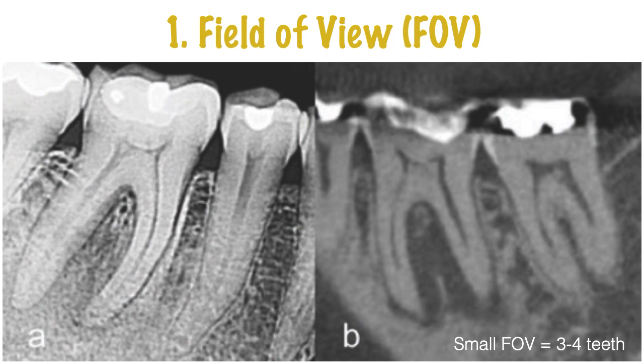If we take a small field of view, or any CBCT scan, regardless of the field of view, we are responsible for reading and interpreting the image in its entirety. If you're not capable or trained to do that, then we have to send that image to an oral and maxillofacial radiologist for reading. However, if we limit the field of view to small, there is a very good chance that we may be able to read the image properly most of the time, although at the beginning, when we are learning, we may need some extra help.